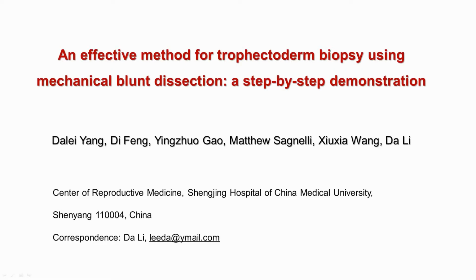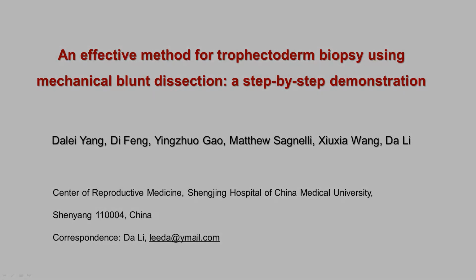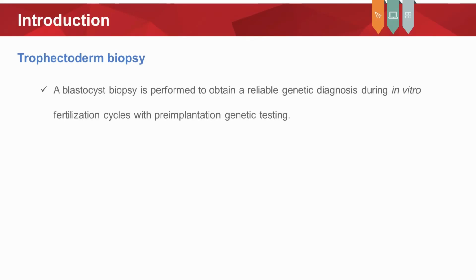This video presents an effective approach to trophectoderm biopsy for blastocysts at different stages and characteristics using the mechanical blunt dissection by Professor Lee's group. A blastocyst biopsy is performed to obtain a reliable genetic diagnosis during in vitro fertilization cycles with pre-implantation genetic testing.